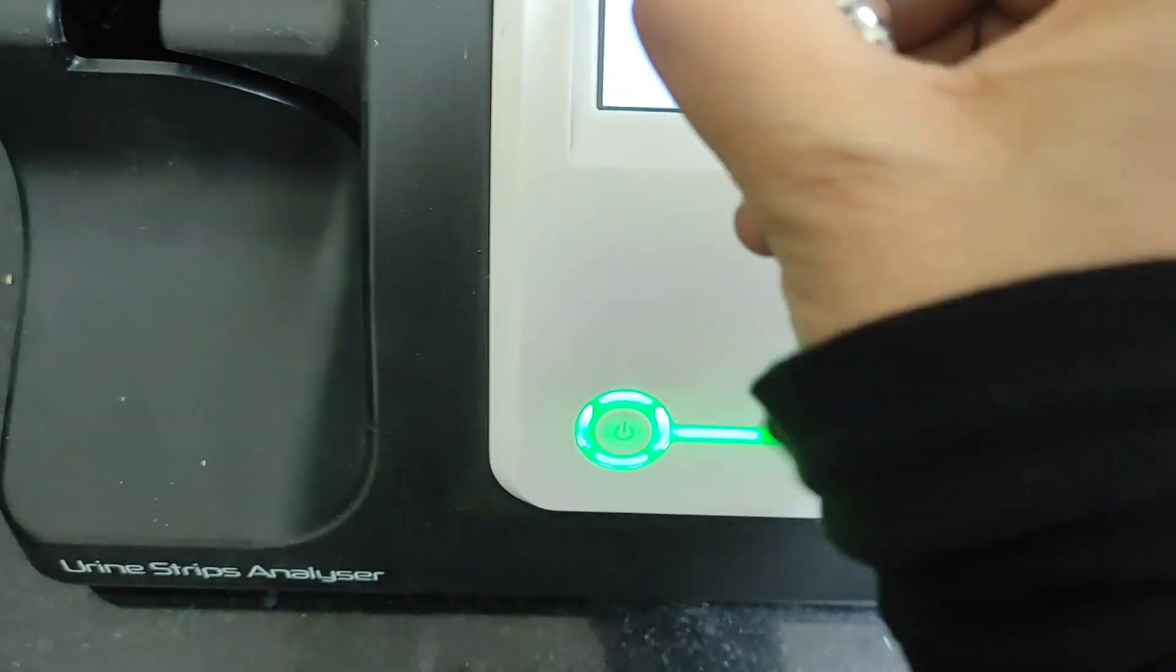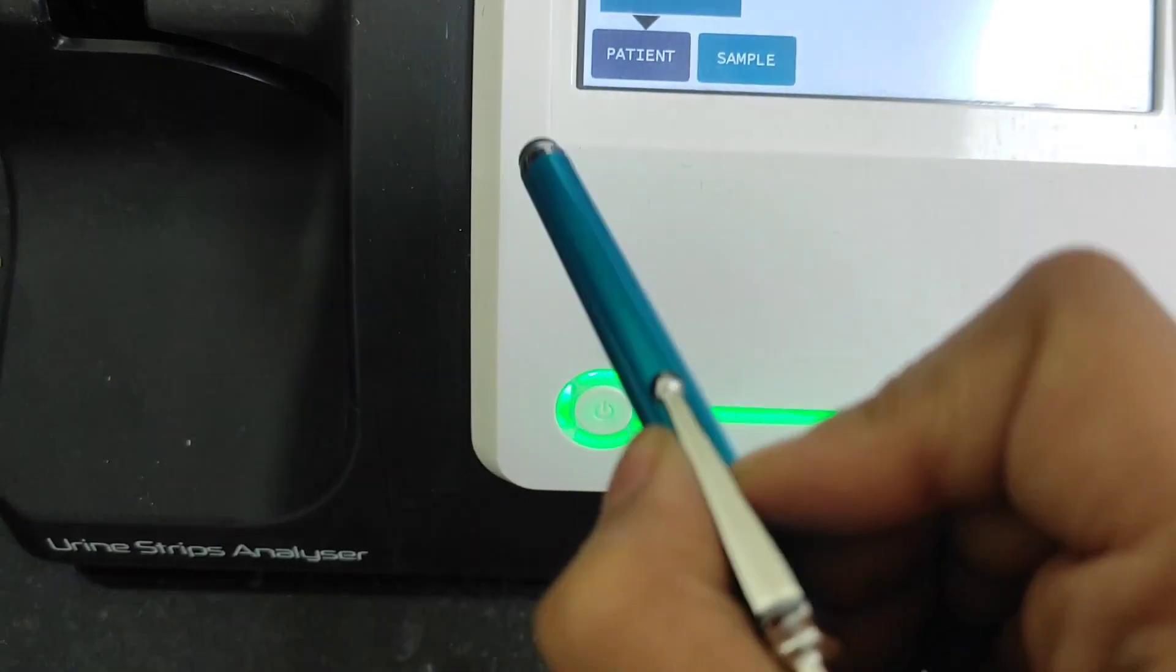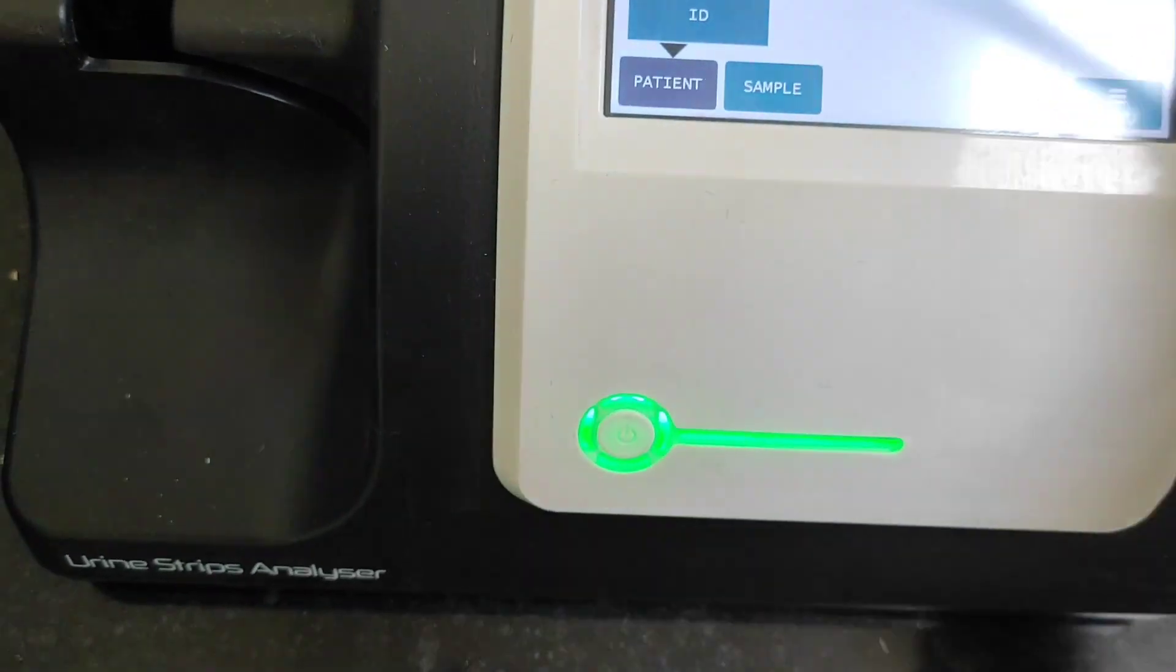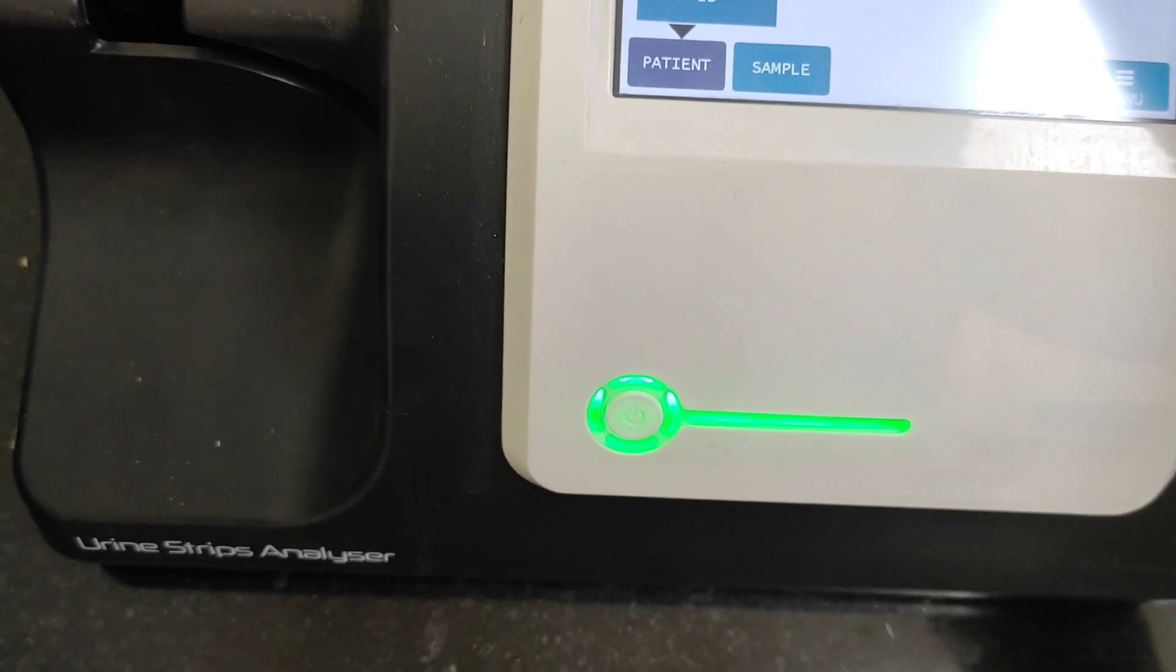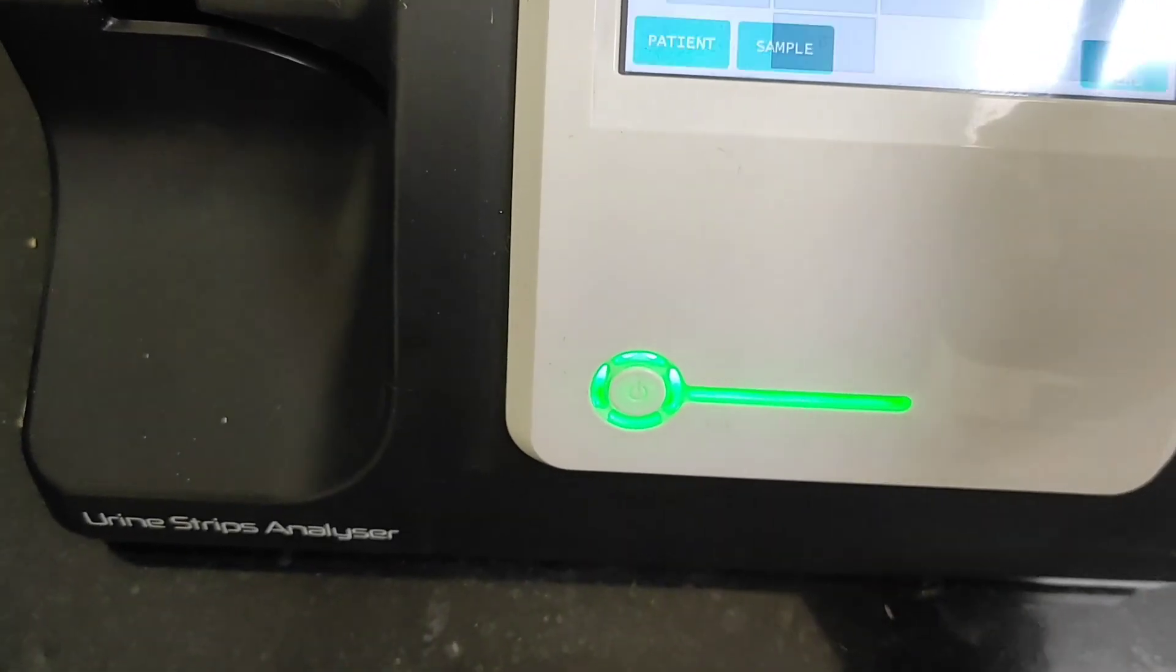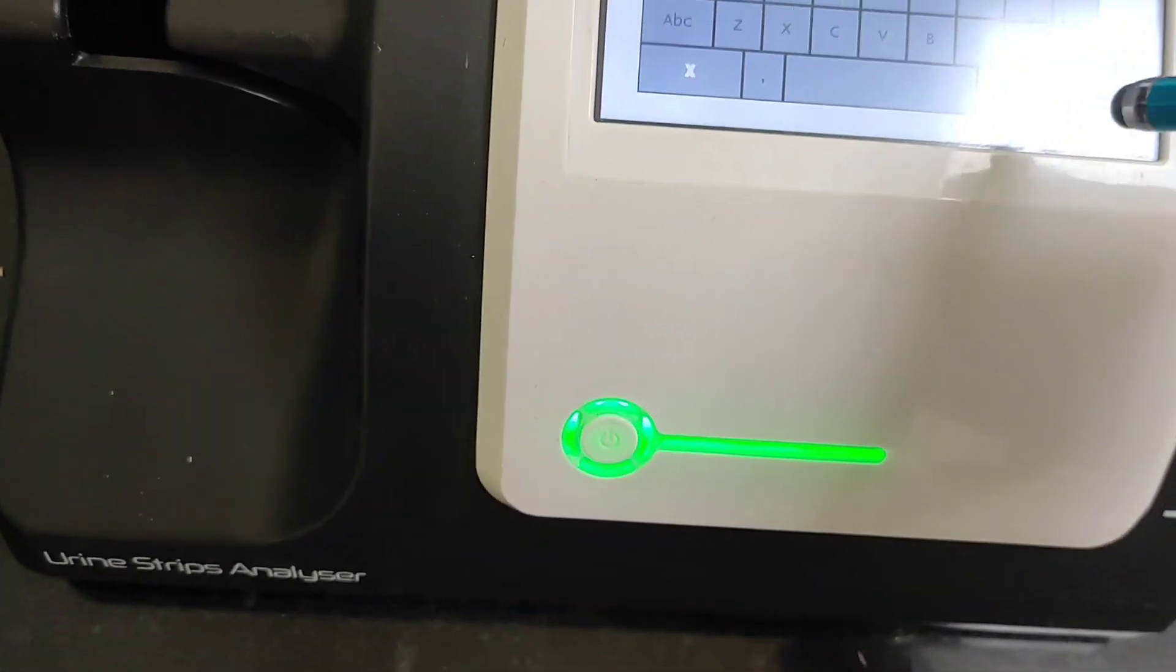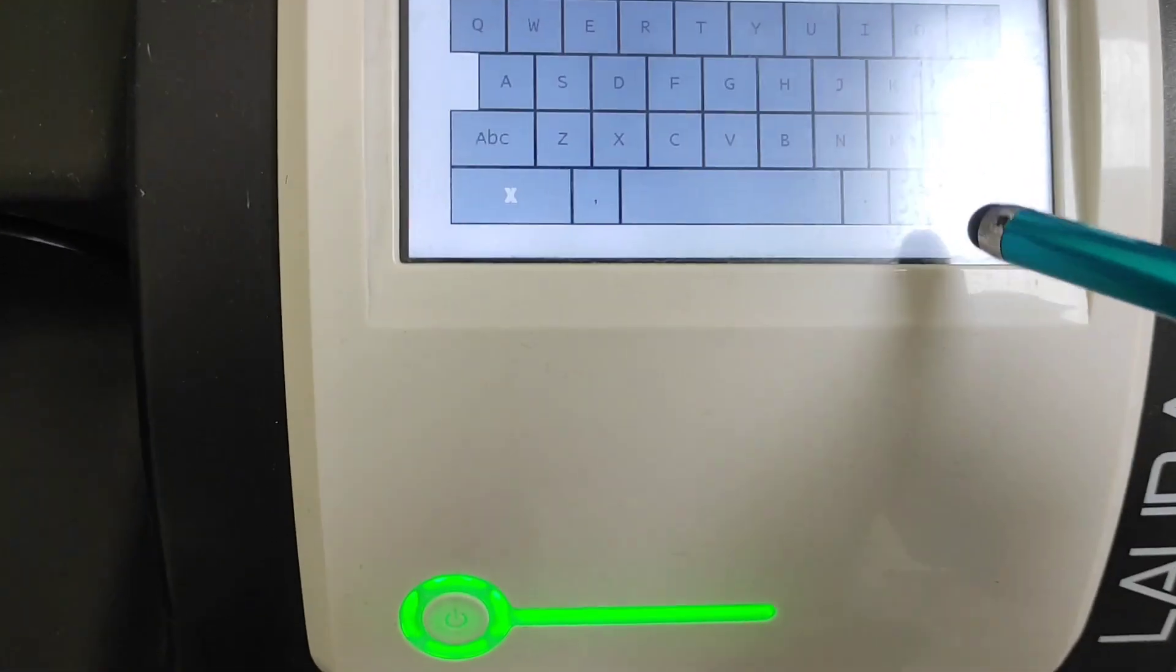Now coming towards the patient, here as you can see there are two options, sequence number and ID. If you have to go for sequence number you will give this sequence number. For example, if the ID or the name of the patient, you can just enter here.